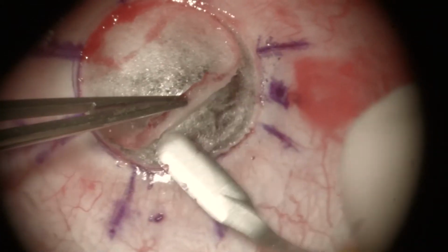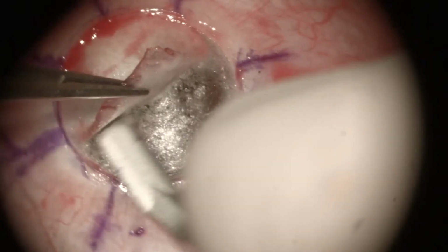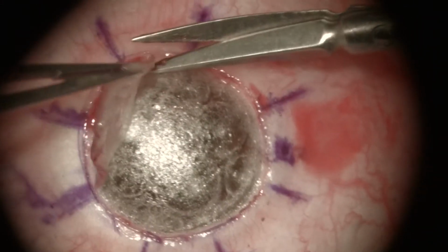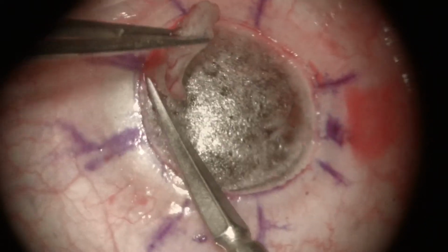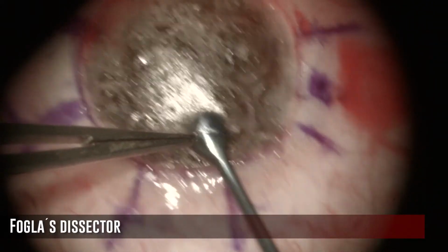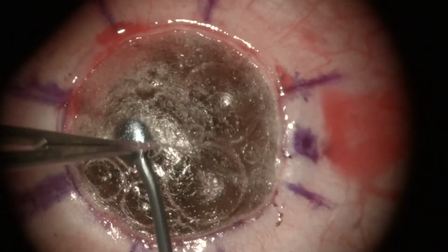As with the big bubble, we strongly recommend draining the aqueous humor through a paracentesis to avoid perforation, since there's less chance to perforate a hypotonic cornea. We continue with a manual delamination with a crescent knife until we reach a plane over the Descemet layer. This step has to be done gently to avoid puncturing. For the final layer, we recommend the use of a Fogla glass dissector, since this is a blunt tool.